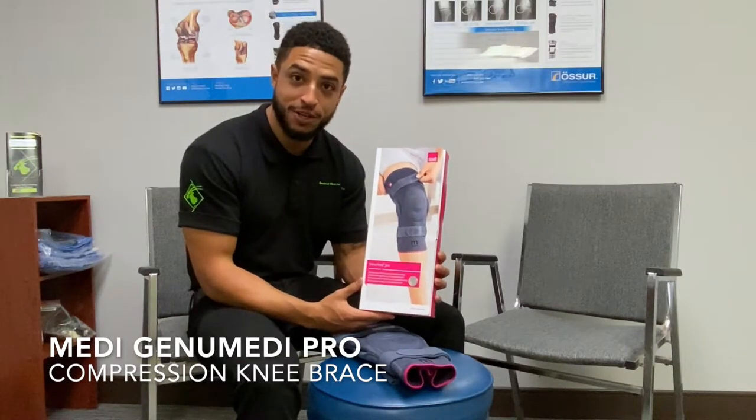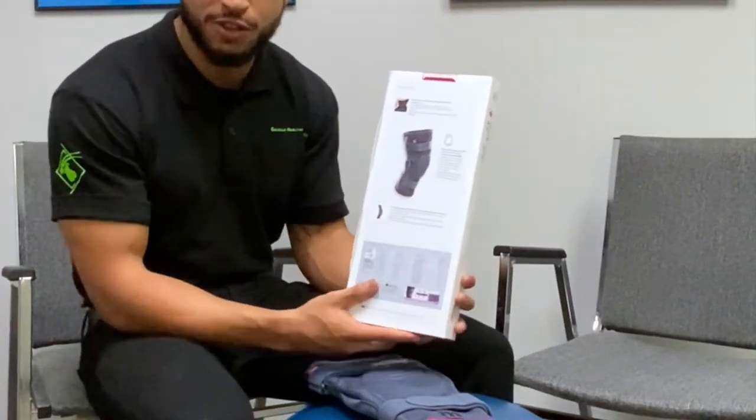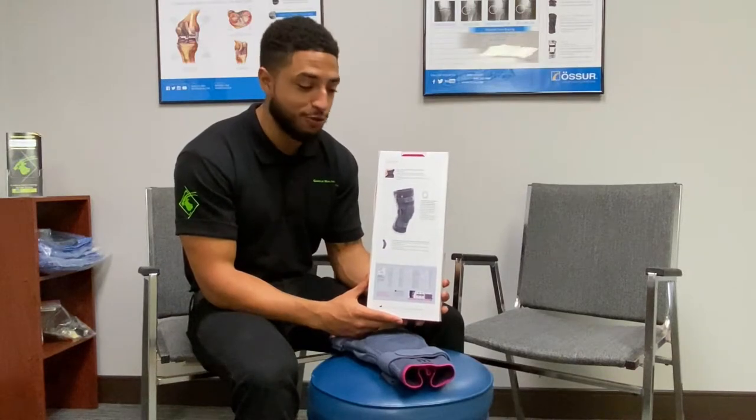So we're here today with the GenuMedi Pro Knee Brace, Double Hinged Knee Brace. We'll be going over some of the features and benefits today for you guys.